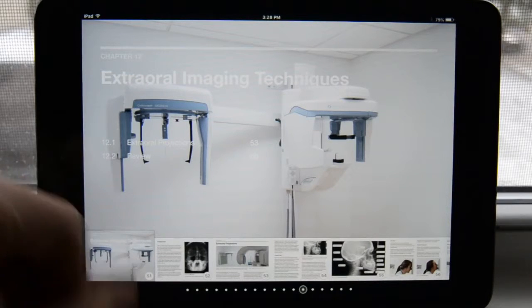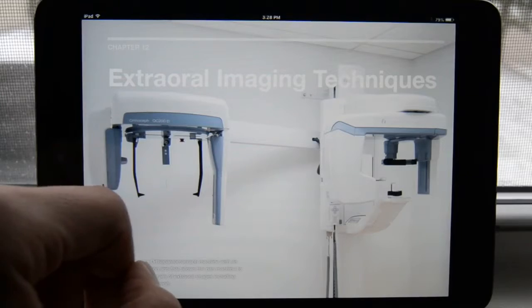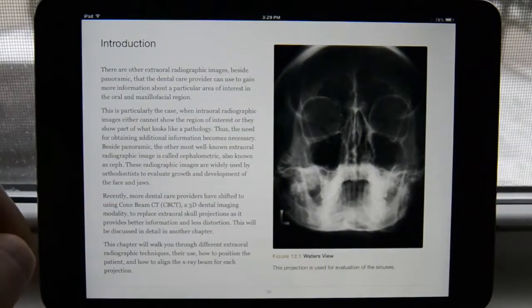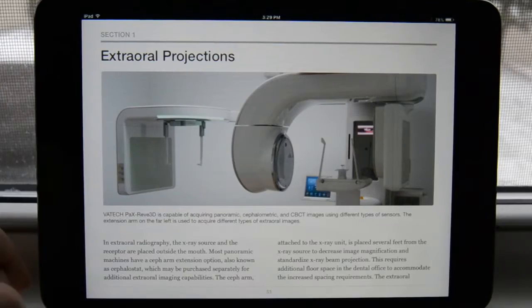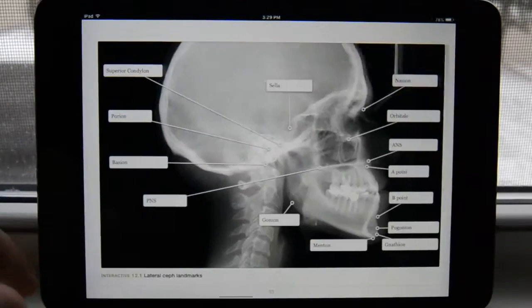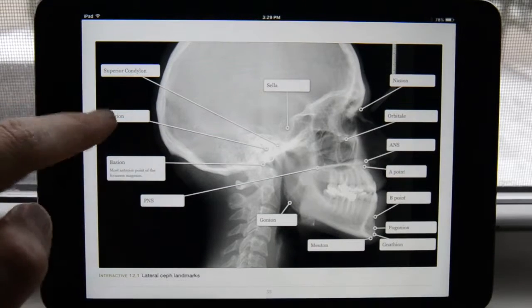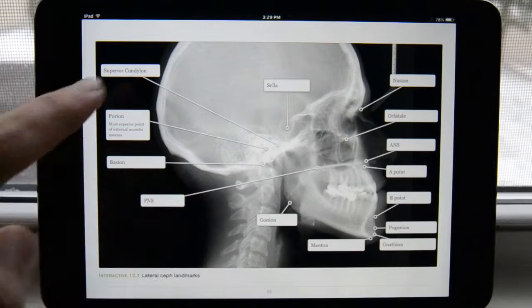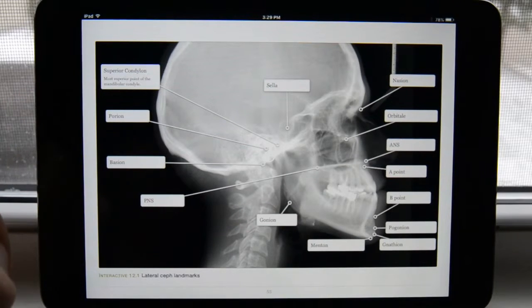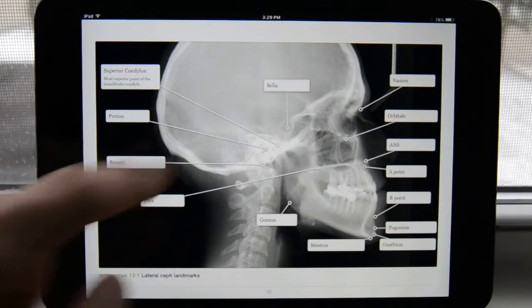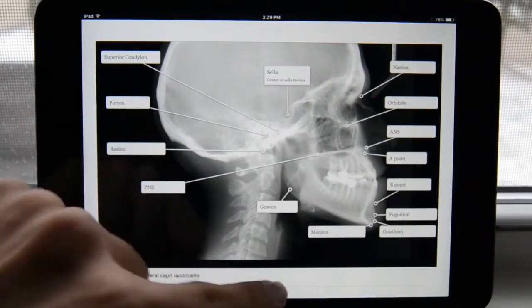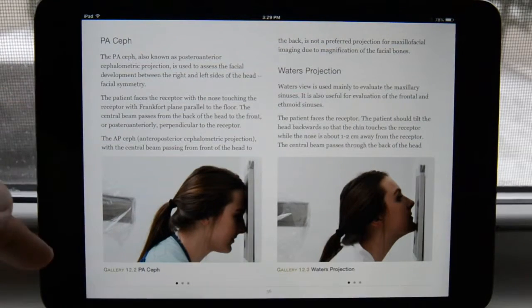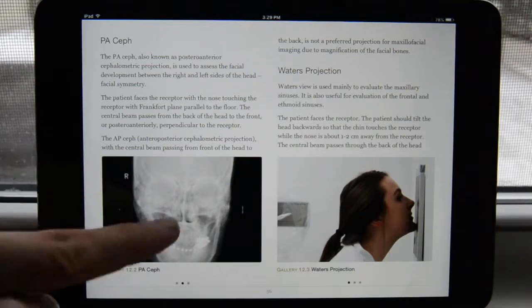We worked on the extraoral imaging technique chapter. We had a dental hygiene student as a model, and she helped us acquire images showing how to position the patient. Here we have a Waters view and we talk about extraoral projections and what machines can be used. With the lateral Ceph, we used the same interactive image approach — all the different anatomical landmarks are laid out, and tapping on each one gives a short description of that structure's significance. Here is our student model showing how the patient should be positioned.